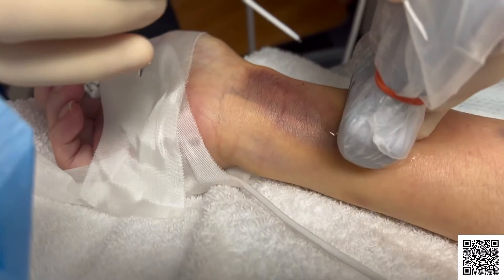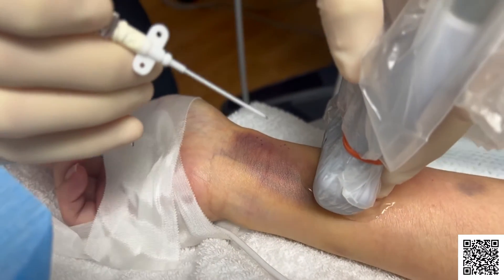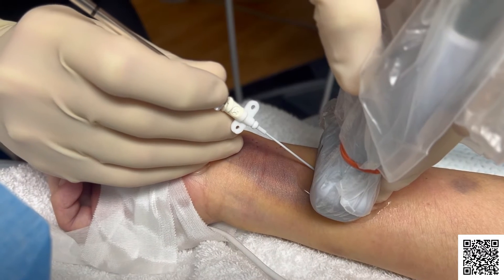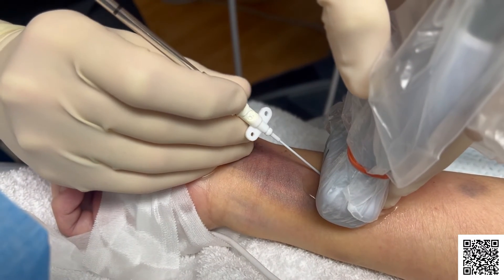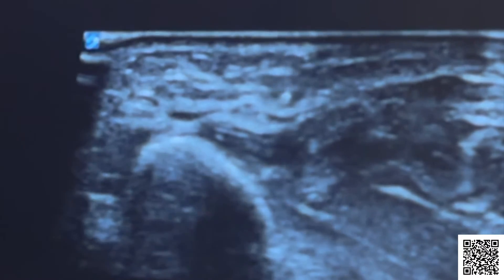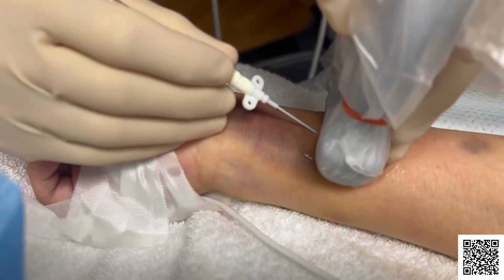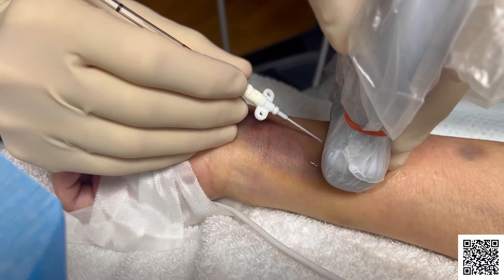To place the line, blood flow through other branching arteries will be checked. This is done to make sure the arterial line will not block blood flow. The insertion site is cleaned and local anesthetic is injected into your skin near the insertion site. This numbs the area so you don't feel pain. A needle is then inserted through your skin into the artery. The needle is used to guide the catheter into the artery. Once the catheter is in place, the needle is removed.